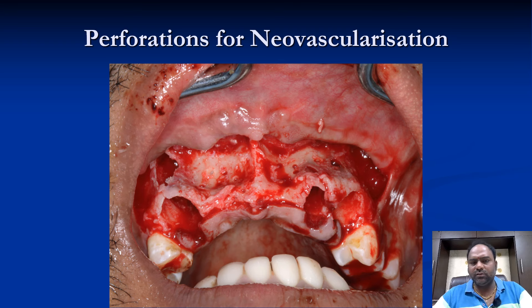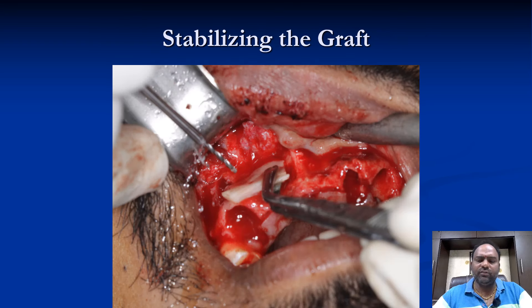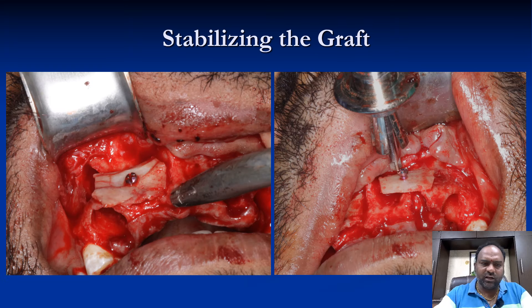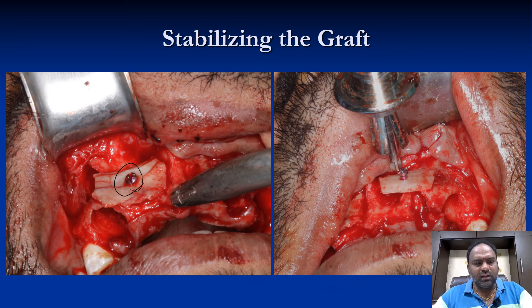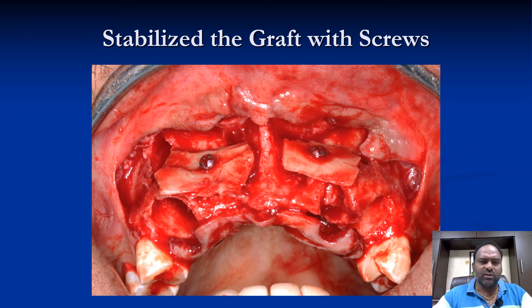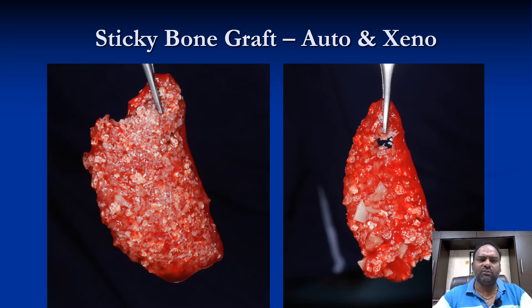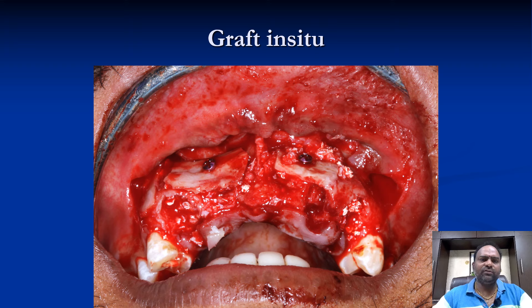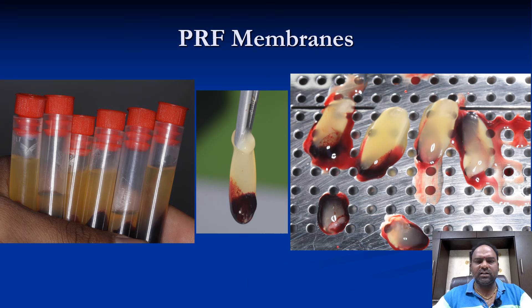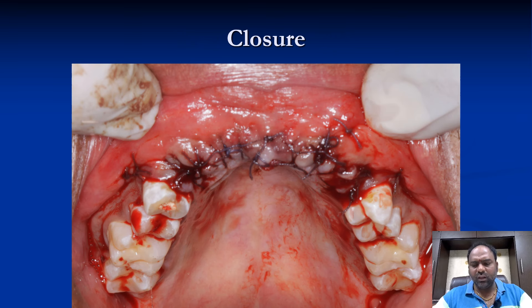We stabilized the graft. There is one mistake I made here — I over-tightened a screw, so that split plate also fractured, but it was still holding well. We then placed the sticky bone graft prepared from IPRF. After placing the graft, we kept some PRF membranes and then did the closure.